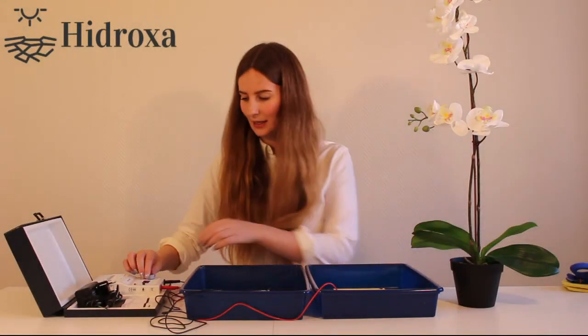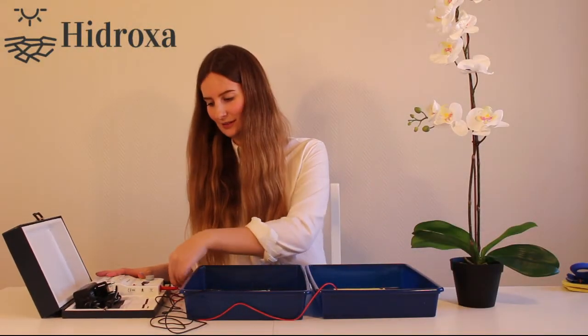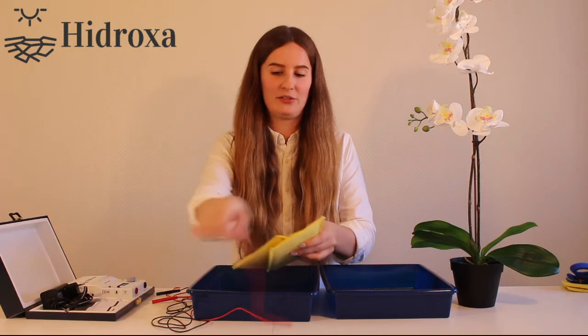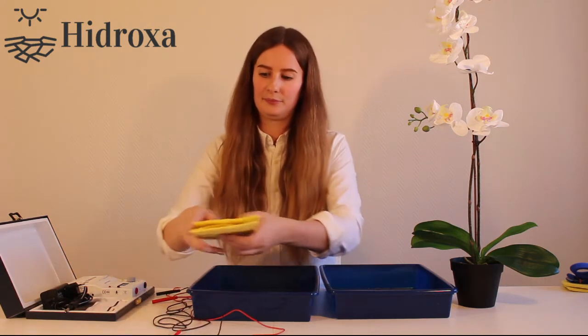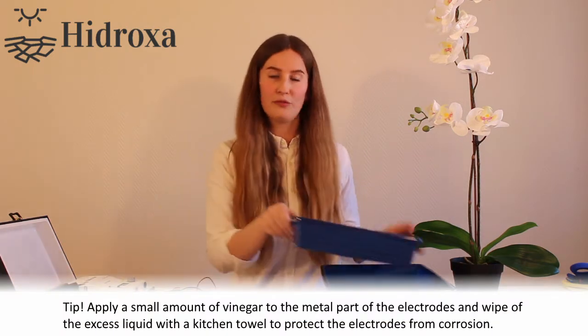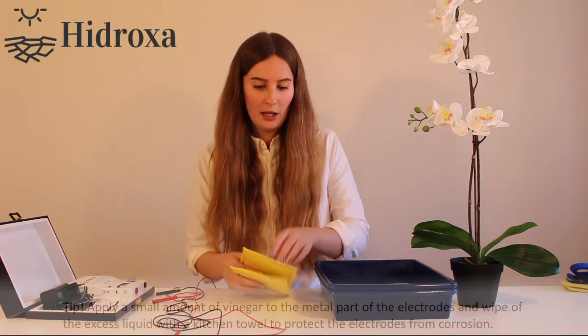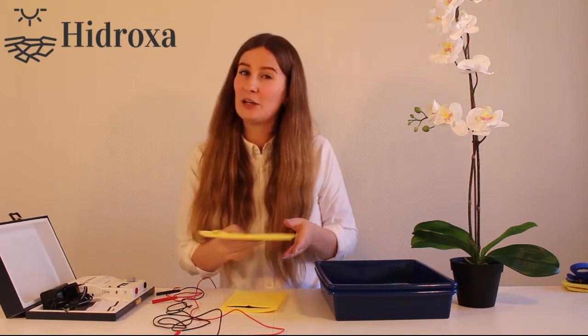When you are finished with your treatment, turn off your device and disconnect the cables from your device. Take out the electrodes from the water and disconnect the cables from them as well. Pour out the water from the containers and gently wash the electrodes under lukewarm water. Please do not take out the rubber electrodes from the pockets as they can be tricky to put back — just gently wash them under lukewarm water and let them dry.